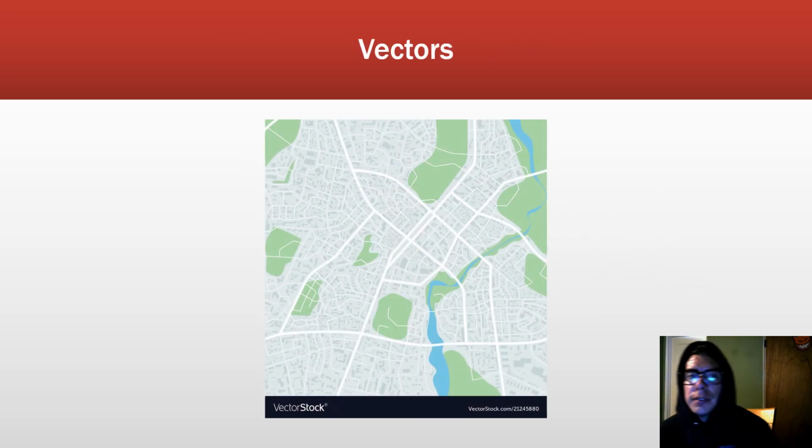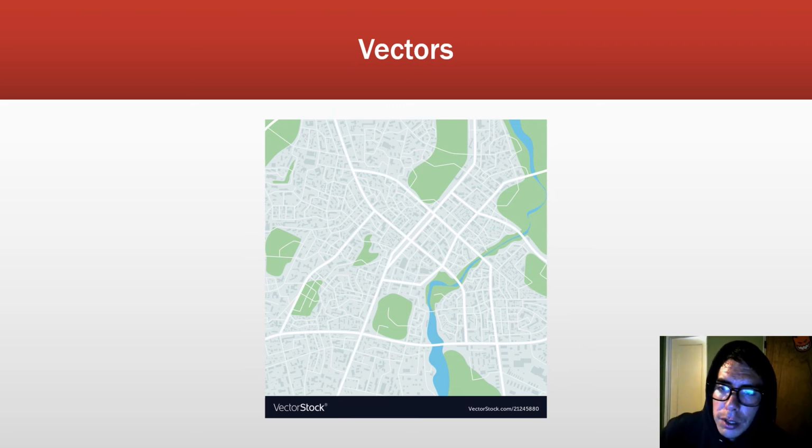And I think we talk about it next, actually. I don't have my notes. So what's being measured is the direction of electricity. That's called a vector, which is the direction.